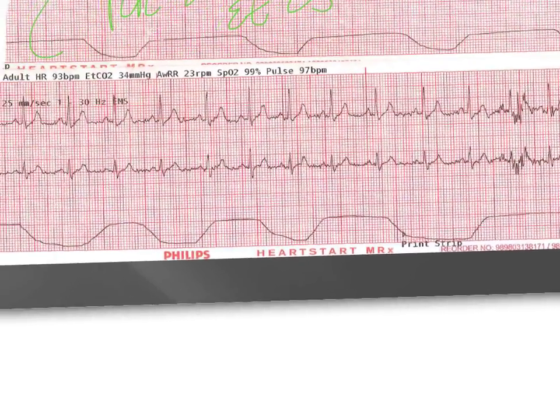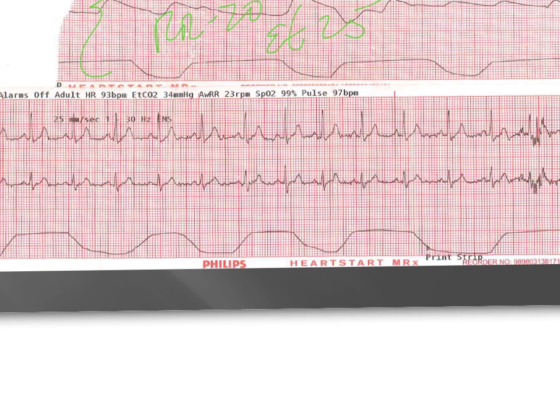Going to the next one, we can see the respiratory rate is a bit quicker, and if we're comparing the waveform from this one to this one, we can see the waveform is not quite as long, which may indicate that we have a quicker respiratory pattern, or it may also indicate, which we'll discuss a little bit later, getting a little ahead of ourselves, that the tidal volume is low.